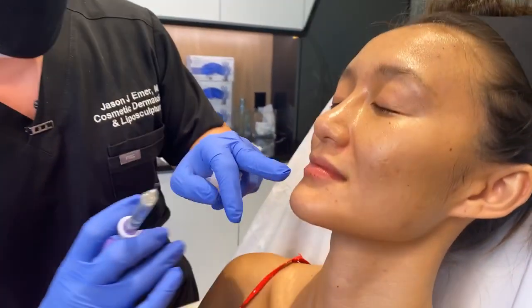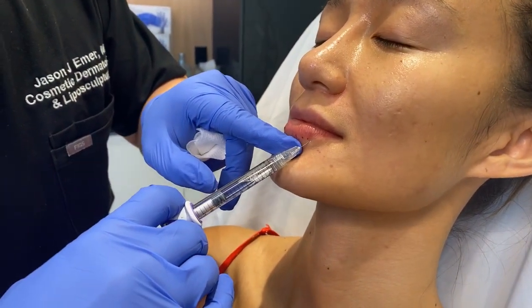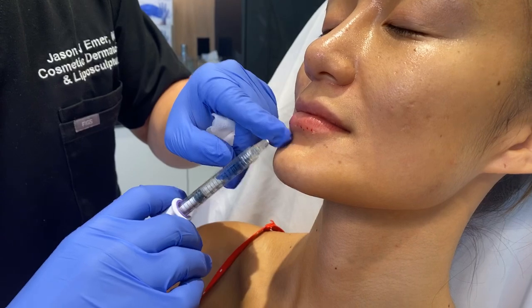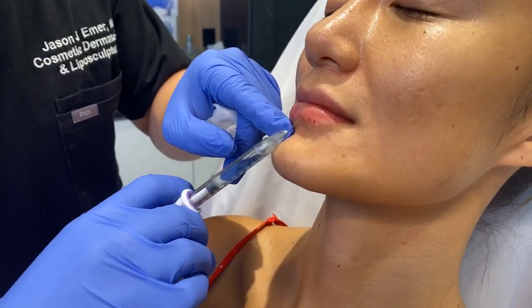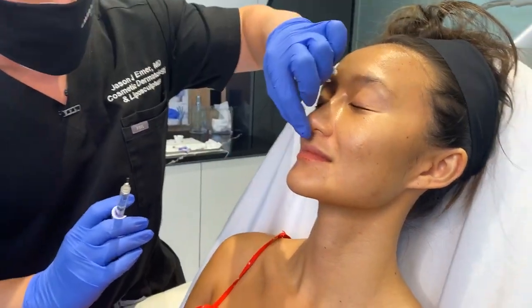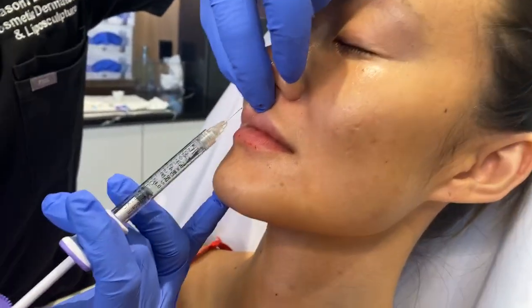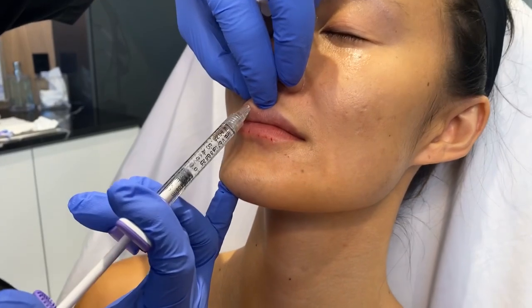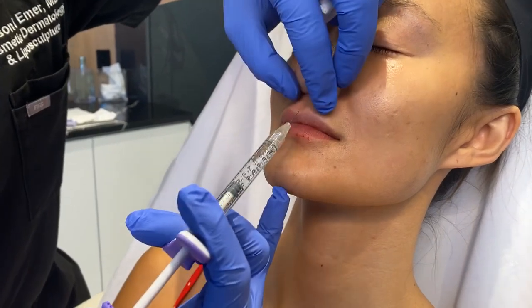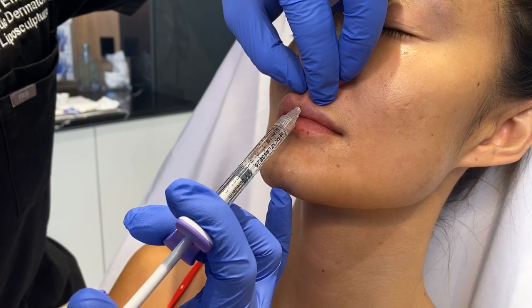So the lower part already looks great. And the cool thing about VOLLURE, you guys, is it actually starts to change a little bit minutes after it's injected. So I like to just sit there a little bit and watch it and see how it looks, because it really does make a difference. It changes a little bit, softens in. Now the other cute thing is she has a really cute Cupid's bow, and that's what gives a lot of definition to females. So we're going to define, this one's a little pinchy, a little bit more in the Cupid's bow by defining the pillars here. Okay, so we're going to go right up into the pillar area, just very small.